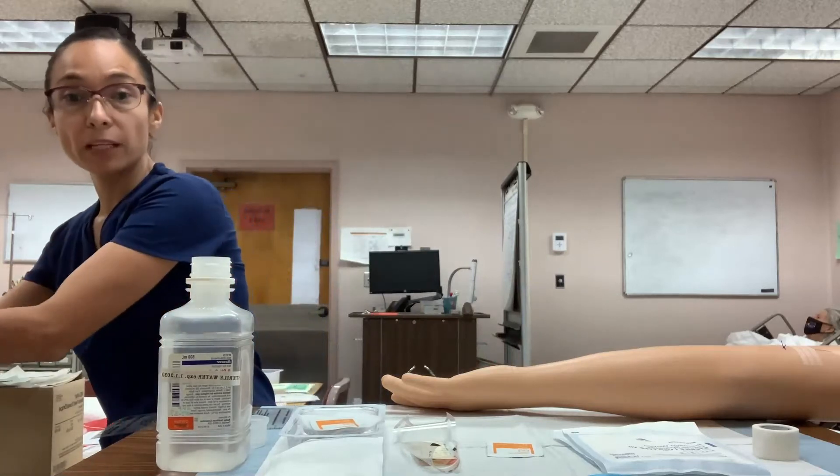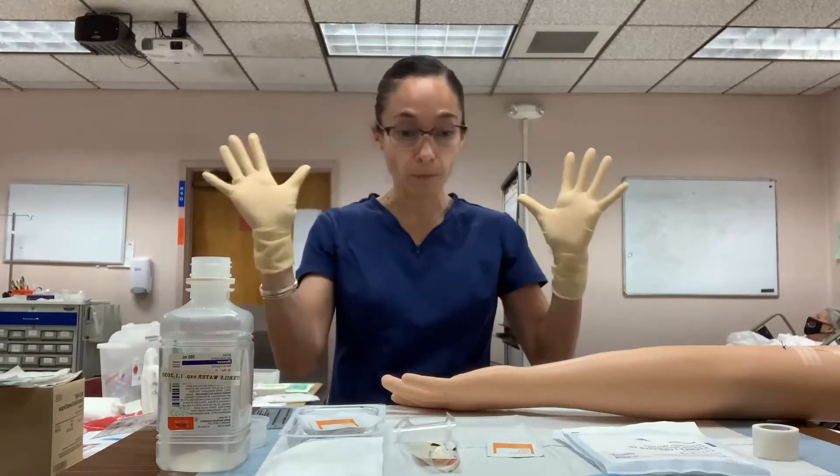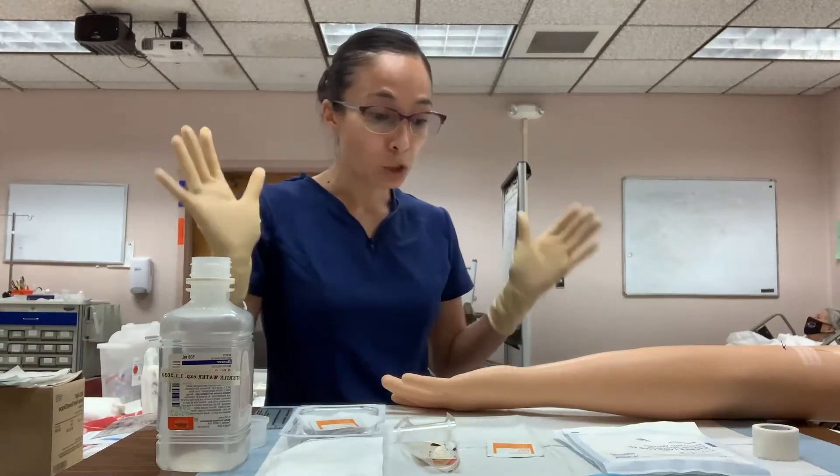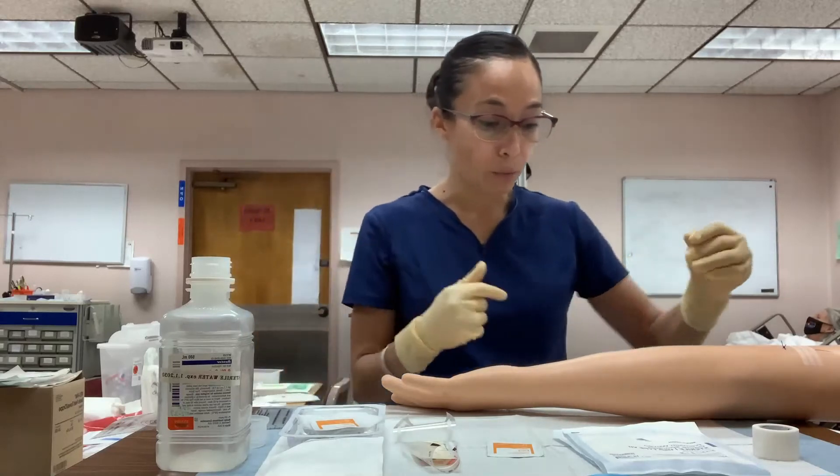After the assessment, your gloves are no longer clean since you've been touching the patient. Remove your gloves, perform hand hygiene, and then put on a new set of gloves before proceeding with wound care. Let the patient know you are going to clean the wound before removing the staples.